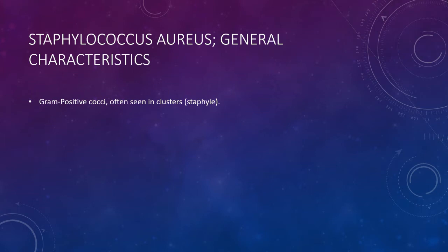When we talk about Staphylococcus aureus, they are gram-positive cocci, and as the name indicates, staphyle means that they are arranged in clusters, like clusters of grapes. They are all catalase positive. Specifically, aureus is coagulase positive, which differentiates it from other staphylococci. The coagulase negative staphylococci form a larger group of staph, but they are clinically less relevant, and Staph aureus is the main pathogen in this genus.